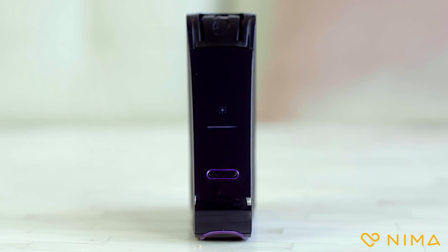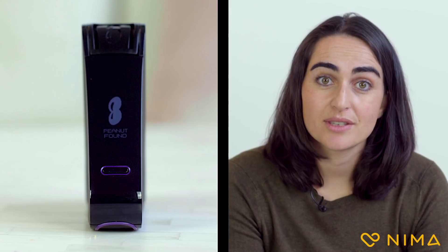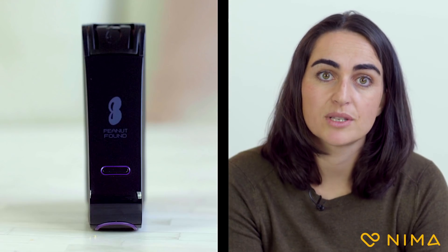The test will take a few minutes. You'll see the screen thinking, and you might hear it working. You'll see a smiley face if it's peanut-free. You'll see a peanut icon if peanut was detected in the sample. Look — I got a smiley!